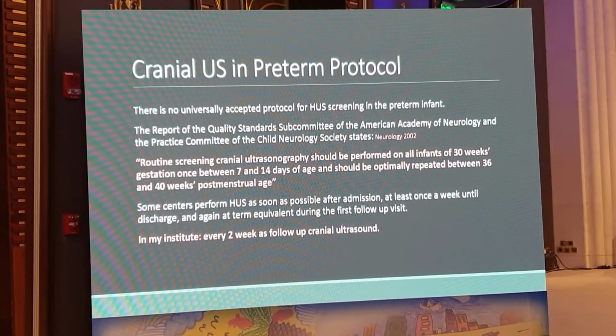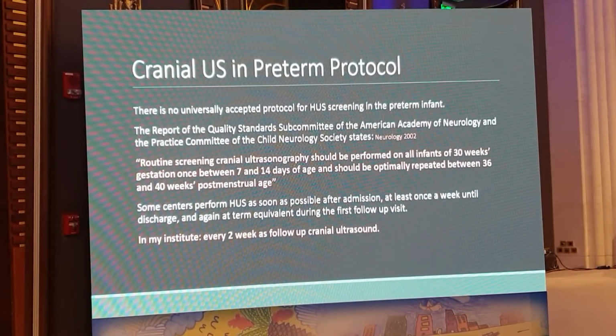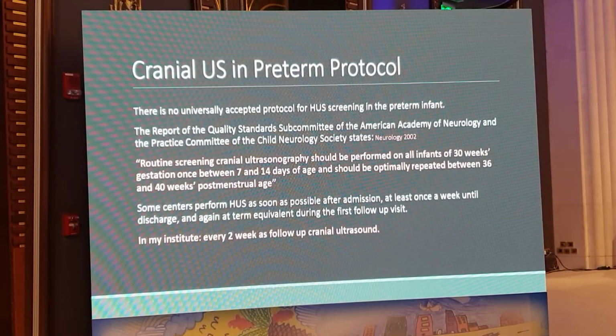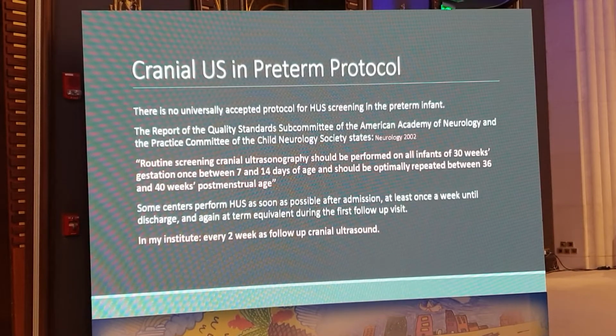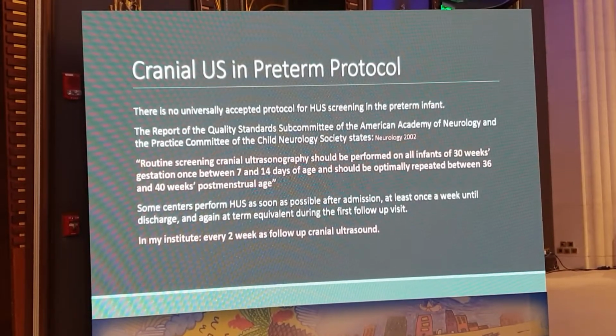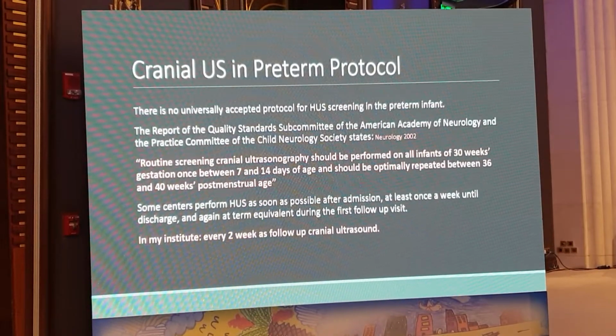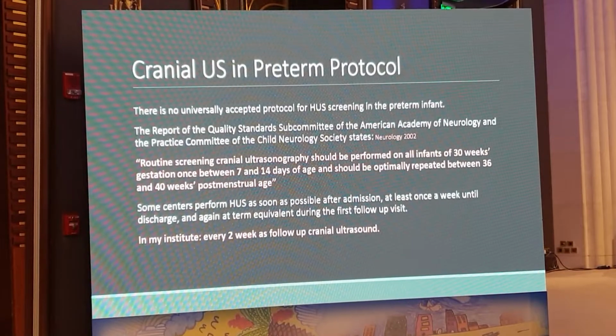I believe that in most centers, the head ultrasound should be done in the first week after birth, and some centers repeat it every week. In our center, we do it every 2 weeks, unless there is a new incident or more urgent need.